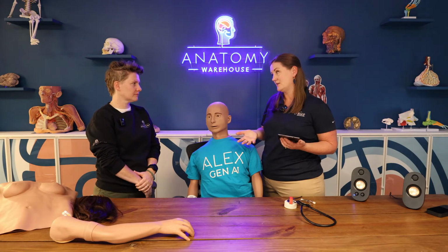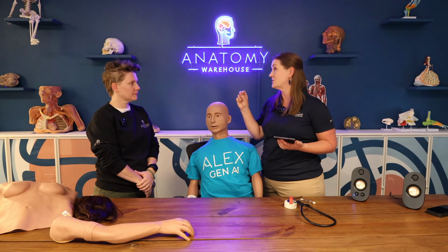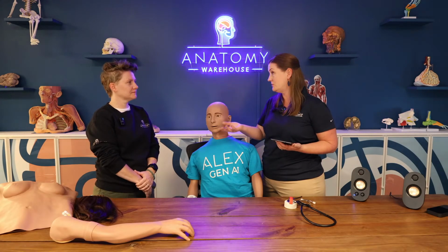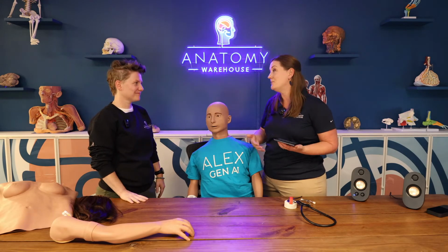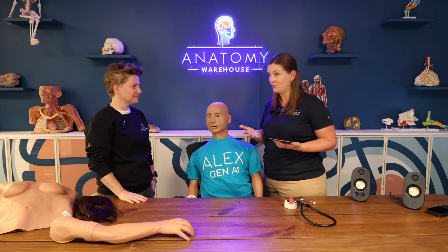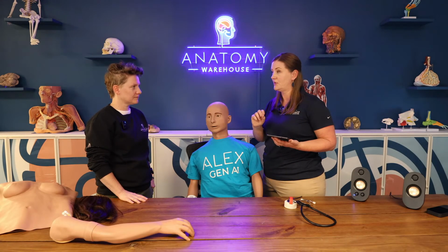The other thing that the simulation log does really nicely too is they can add any kind of comments or content right into that simulation log. So student Liz did really good with developing a rapport with the patient, making them feel comfortable, helping them through the car accident issues. However, she didn't apply the blood pressure cuff correctly.